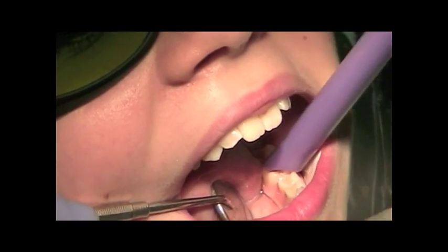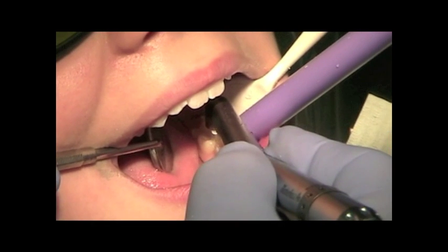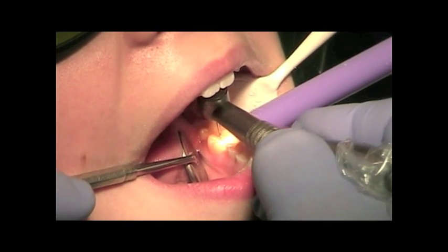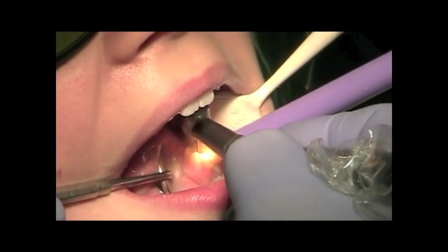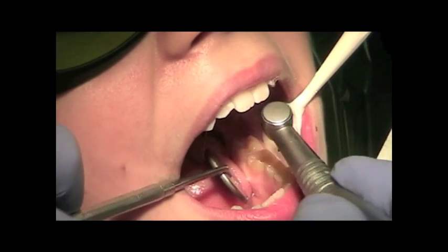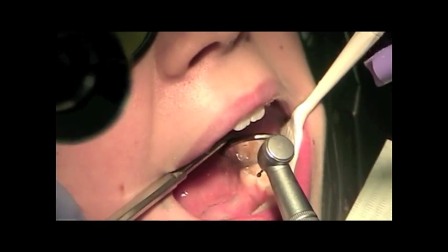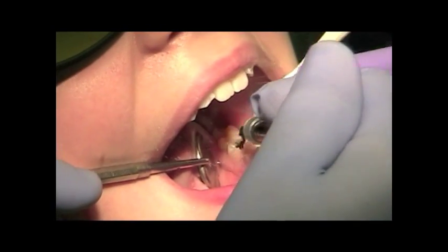Two areas of decay, in the same way we did the other tooth. The tooth now has laser analgesia, and they're looking very light. The tooth is very light.